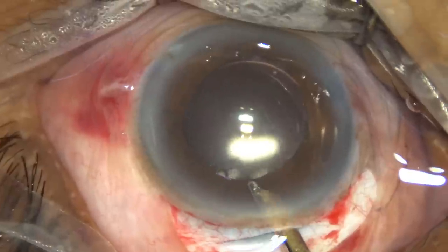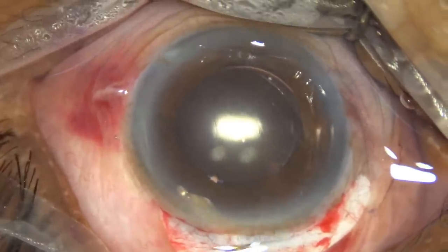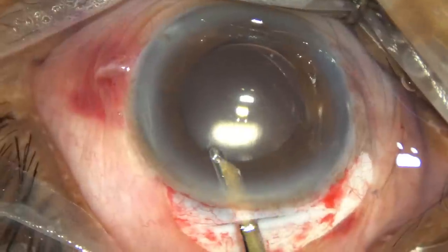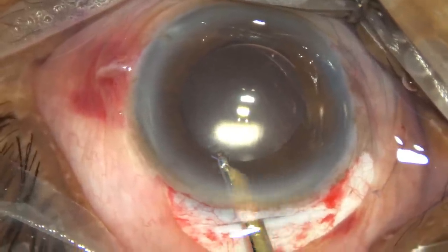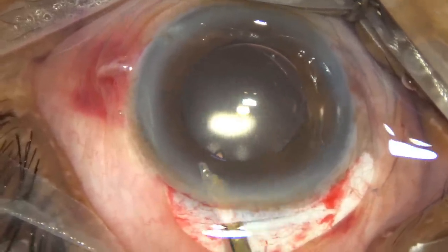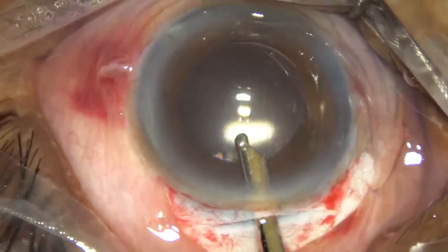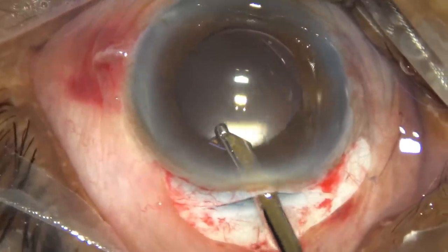We had a stuck nucleus at the incision. We pushed it from behind through the side port with the SICS hook, then rolled the nucleus out. Thus, the nucleus was delivered in this case.